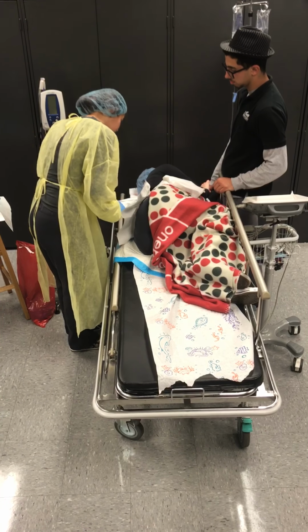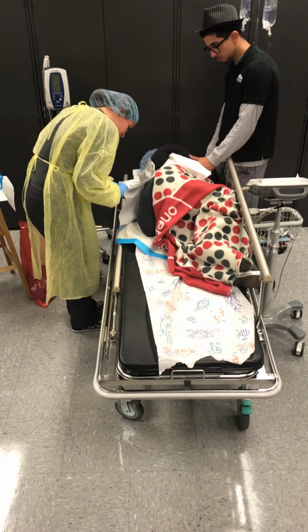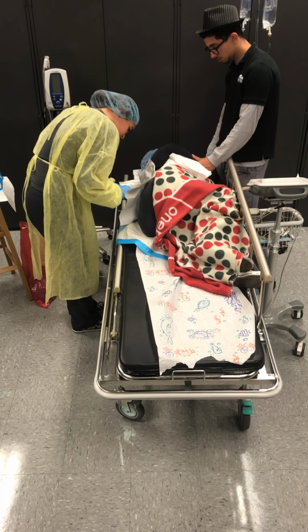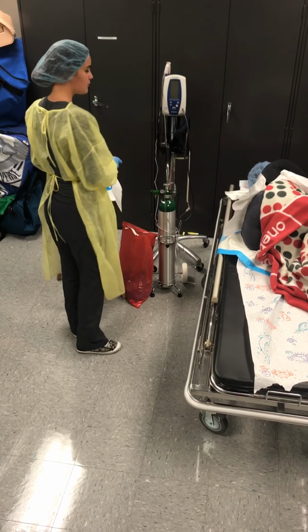Okay, you're going to take one deep breath for me. Okay, sweetie. Good. One more. One more. Take a deep breath. Okay, sweetie, just breathe. One more deep breath. We're almost done, okay? One more deep breath. One more. Last breath. And good. Remove sterile gloves and dispose of appropriately.